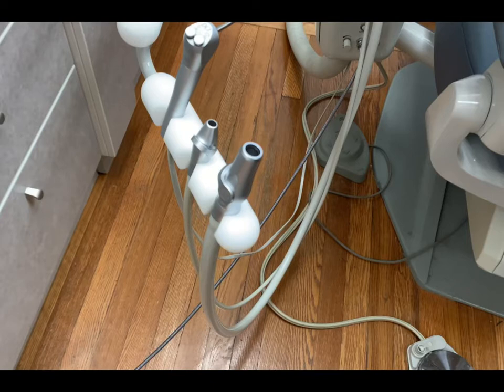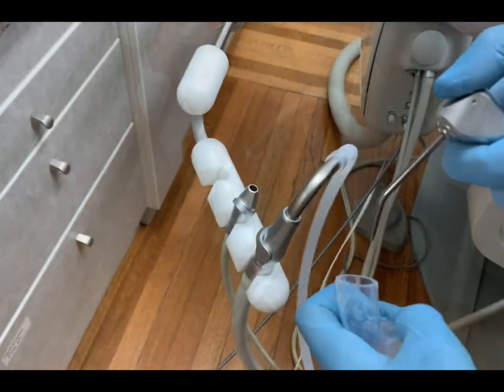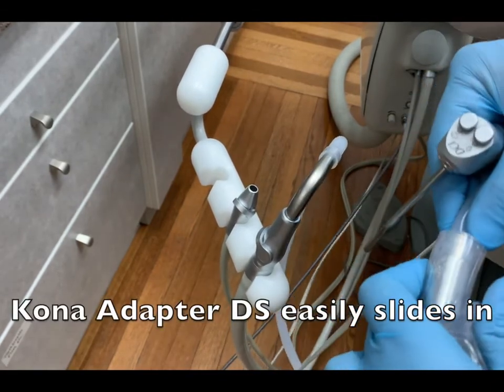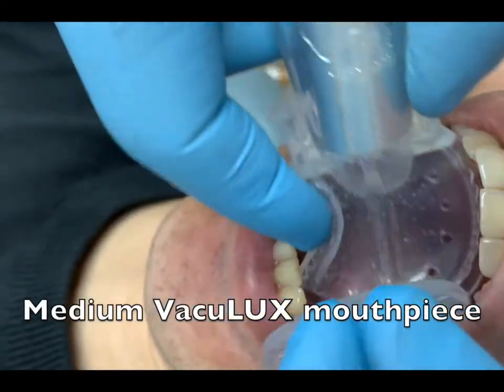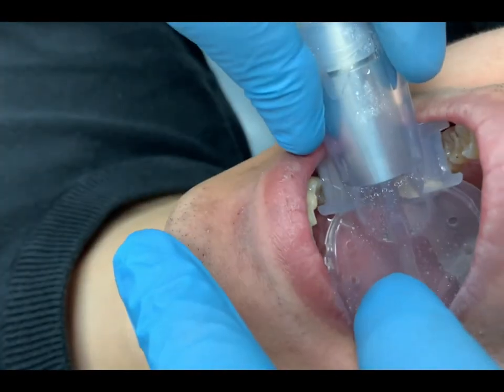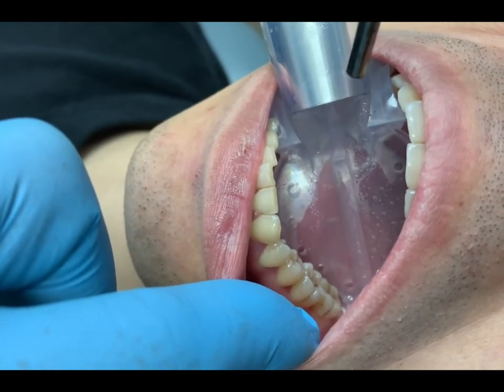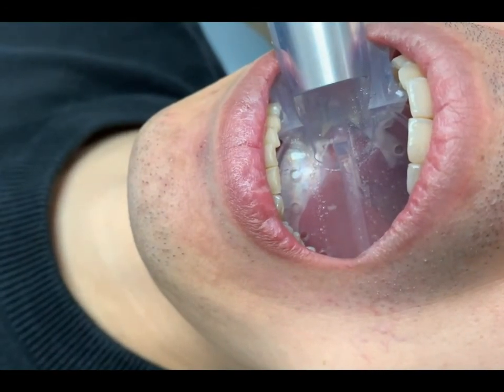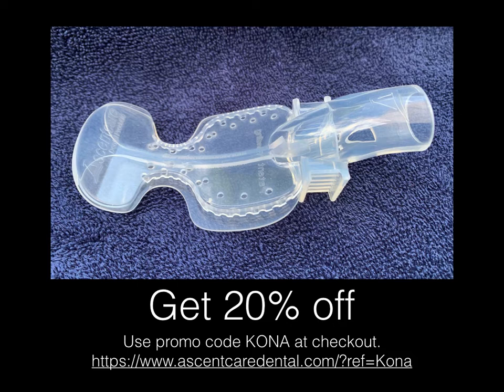This is a short video clip of me demoing the Kona Adapter DS with the VacuLux medium mouthpiece. I was recording with my iPhone, so it's very close to the patient and might sound a little loud, but it's actually very quiet compared to other systems.